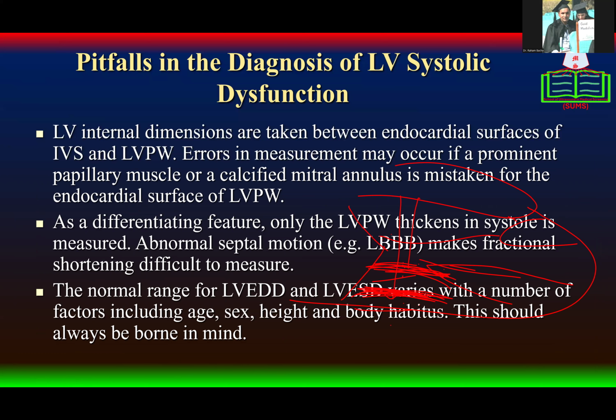The normal range of left ventricular end-diastolic dimension and left ventricular end-systolic dimension varies with a number of factors. For different ages, both of them will be different. For different gender, and for height, body habitus, and so on.